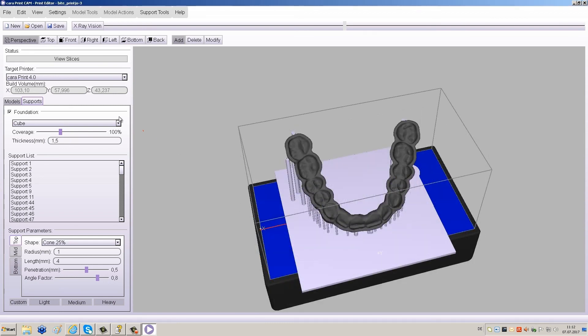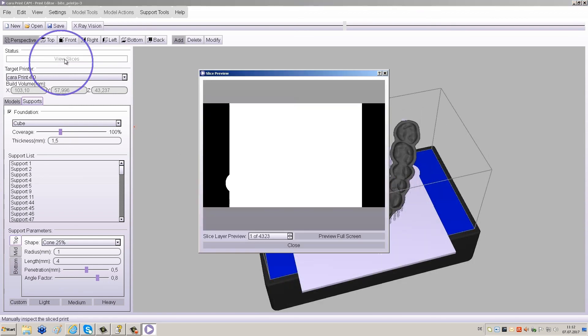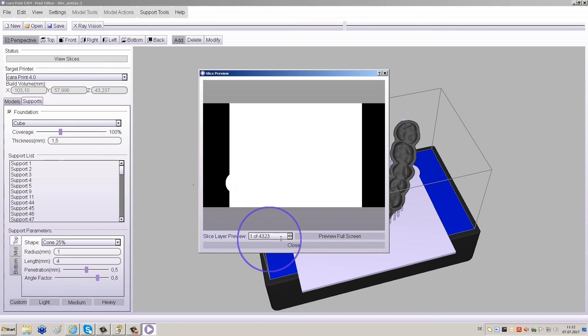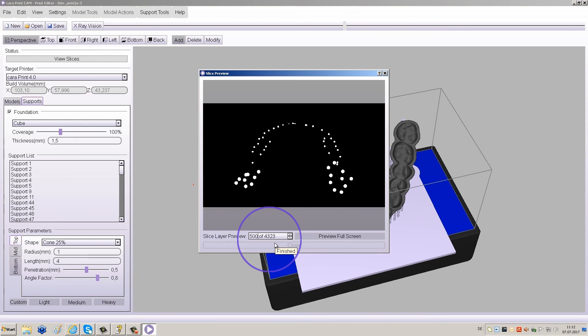If you would like to review individual layers, click View slices to the top left of your screen. In the window that appears, you can type in individual layer numbers or scroll through them by holding the arrows.